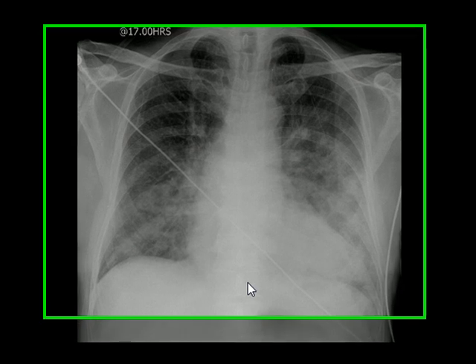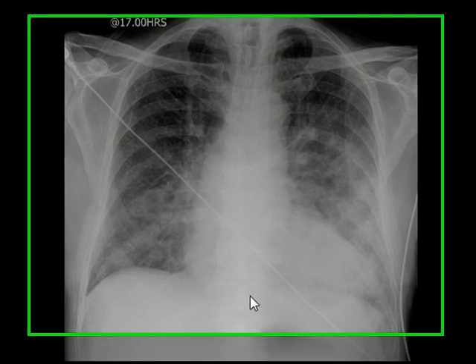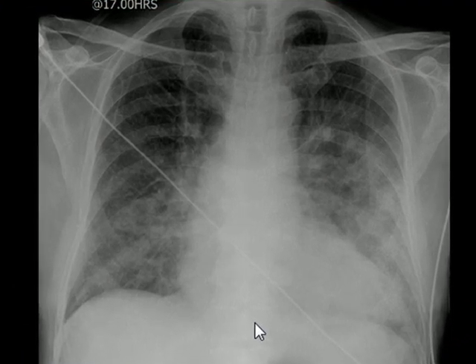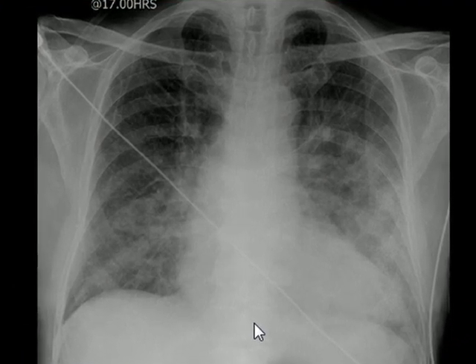Excess fluid leakage from capillaries and its collection within the interstitial space is known as interstitial edema. At a later stage, this fluid can enter into the alveoli of the lungs, which is known as alveolar edema. Both are very frequently described by the common term pulmonary edema.